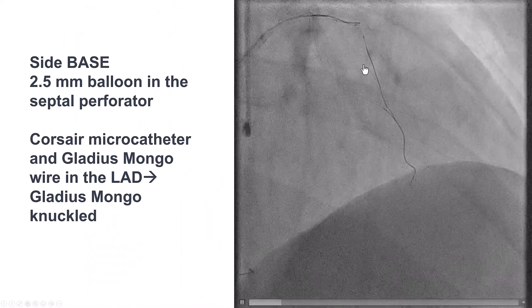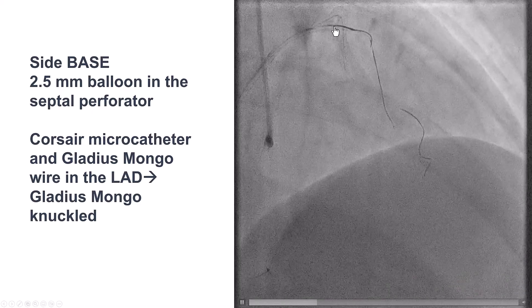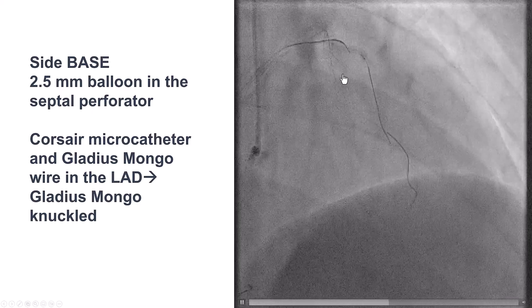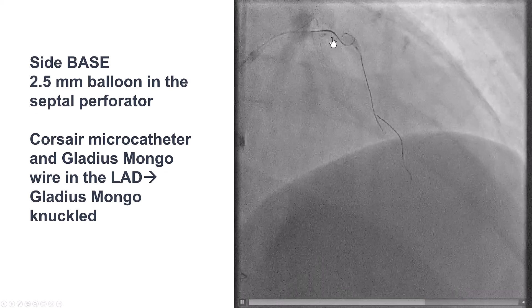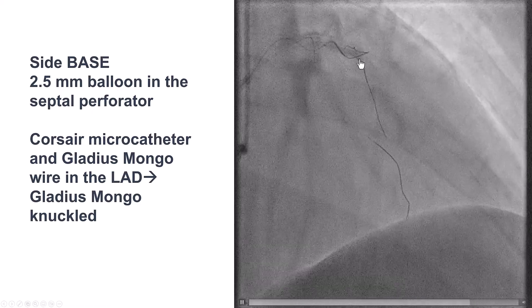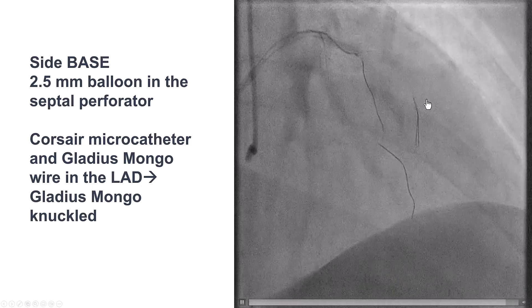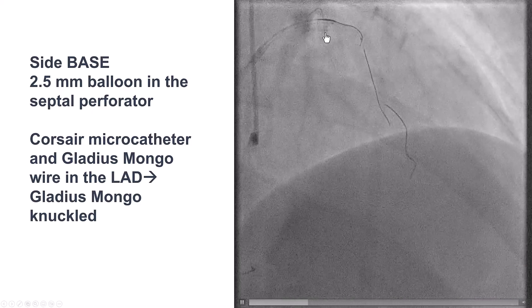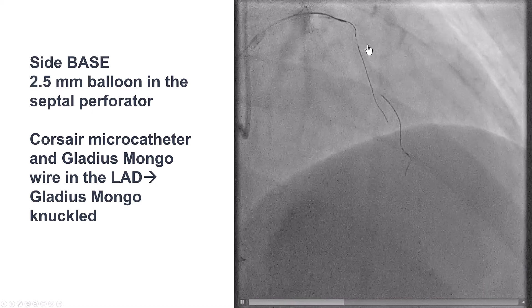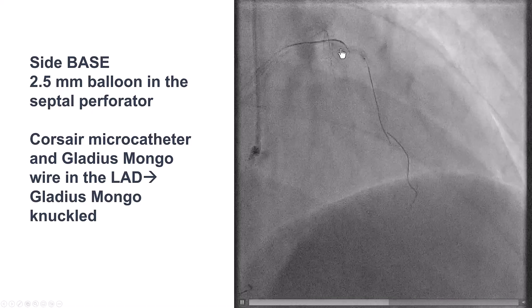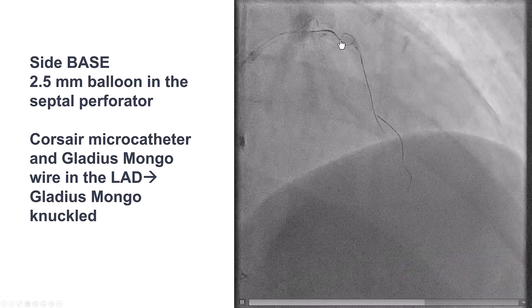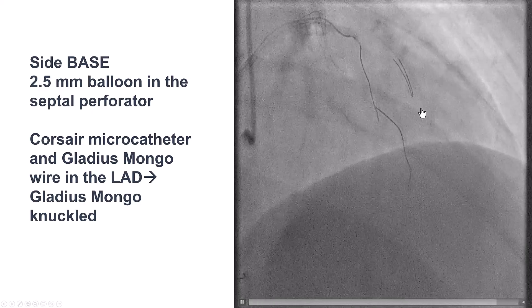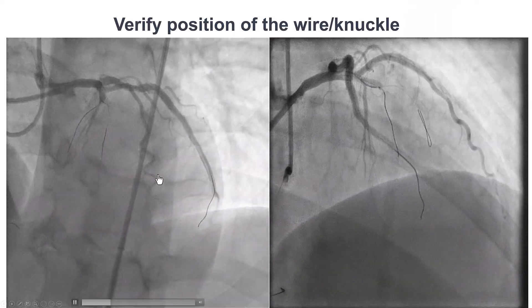We used a 2.5 mm balloon into the second septal branch and a Corsair microcatheter advanced next to this balloon. The balloon was inflated, and then we used a Gladius Mongo guide wire, knuckling it and advancing it further down. The wire eventually took a knuckle and advanced along the course of the vessel — a nice example of the side-base technique. The balloon anchors the Corsair microcatheter, providing extra support so the Gladius Mongo loop finds the extraplaque space and advances down the course of the LAD.